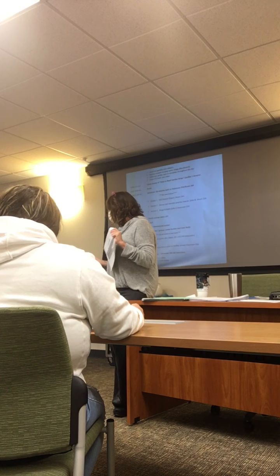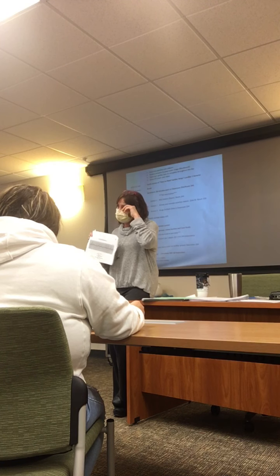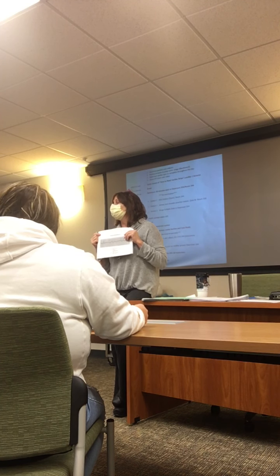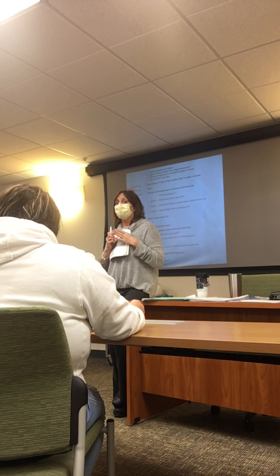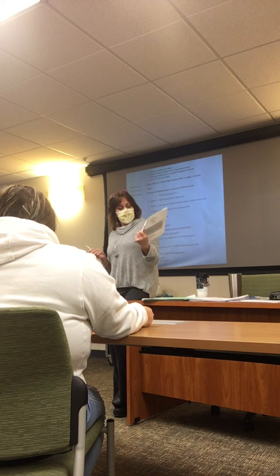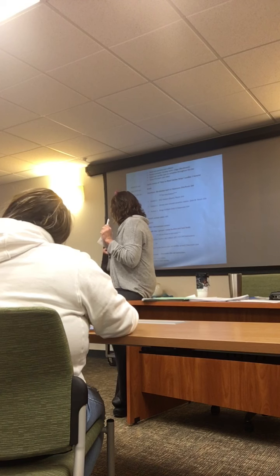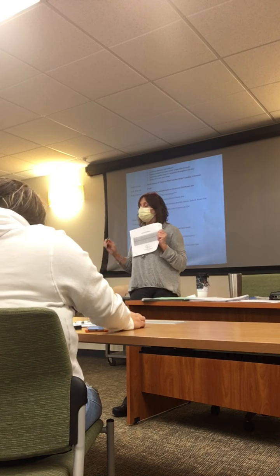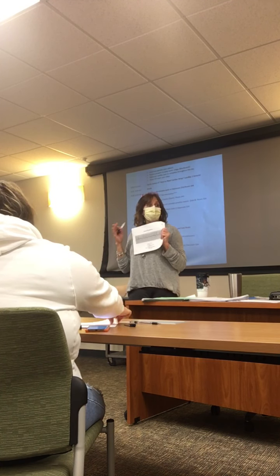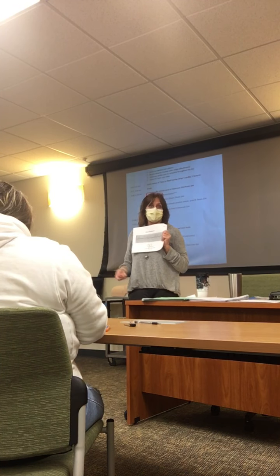What do I want to assess about a person if they come in and I hook them up to the monitor and I see they're in this rhythm? What are things that I want to assess? Good. So if they're short of breath, are they having chest pain, chest palpitations? What's their blood pressure? Some people are able to tolerate rapid rates for a short period of time. Usually with atrial fib, if we can get the ventricular response rate down to normal, between 60 and 100, people will live with this for years and years and years. And it's the most common heart rhythm to be in besides normal sinus rhythm.